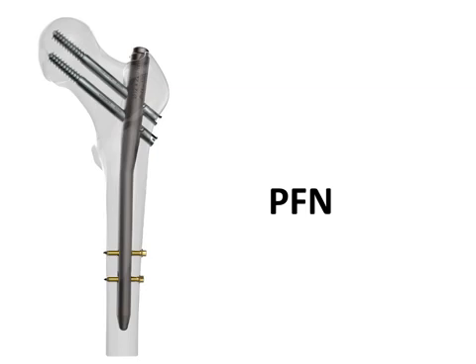If they say it's an undisplaced intertrochanteric fracture, simple two-part, then still you can choose dynamic hip screw as a treatment of choice. But for practically any displaced intertrochanteric or subtrochanteric fracture, comminuted fractures, or a reverse oblique fractures, now the proximal femoral nail has become the treatment of choice for the proximal femur fixation.